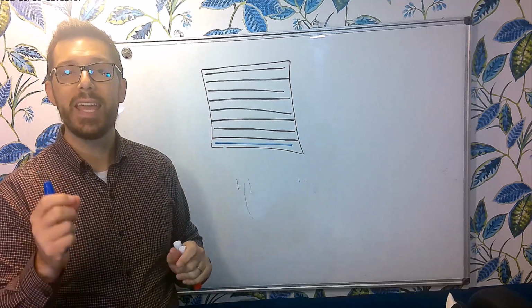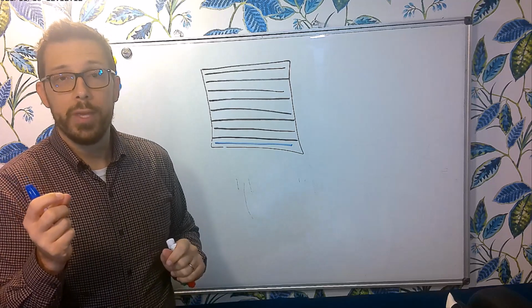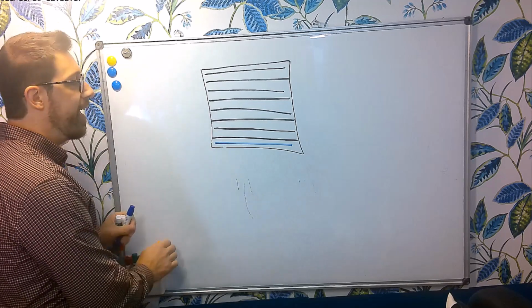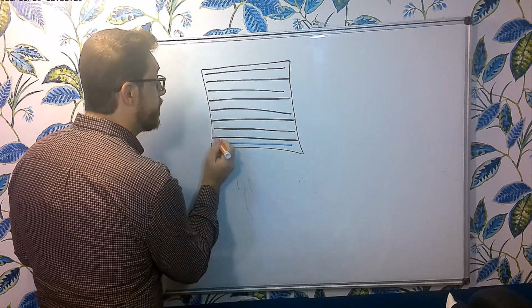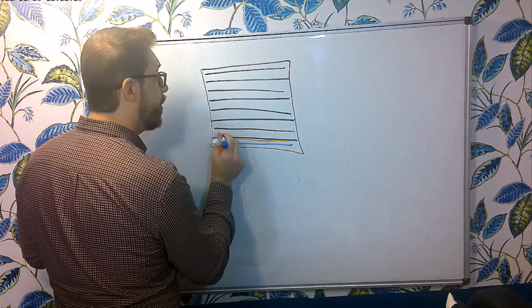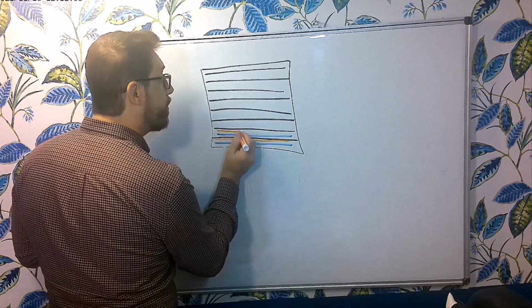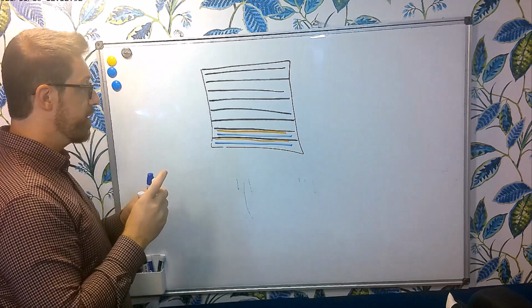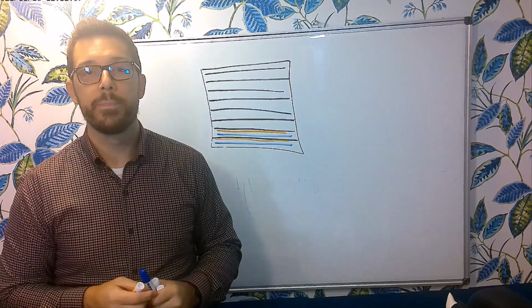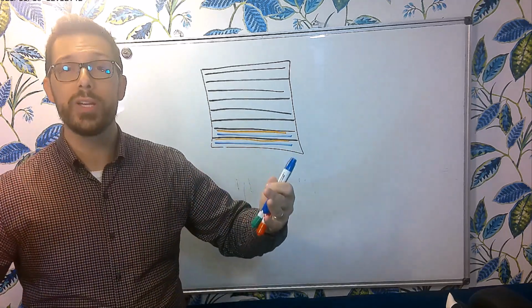And what happens if I take my number of signal averages and bring it to, let's say, 2? What is happening is when I fill this line of K-space, I go back and I fill it again. So I fill it twice. Then I move on to the next line, I fill it with an echo, and then fill it again with another echo at the same spot in our K-space. And I do this until I fill my entire K-space.